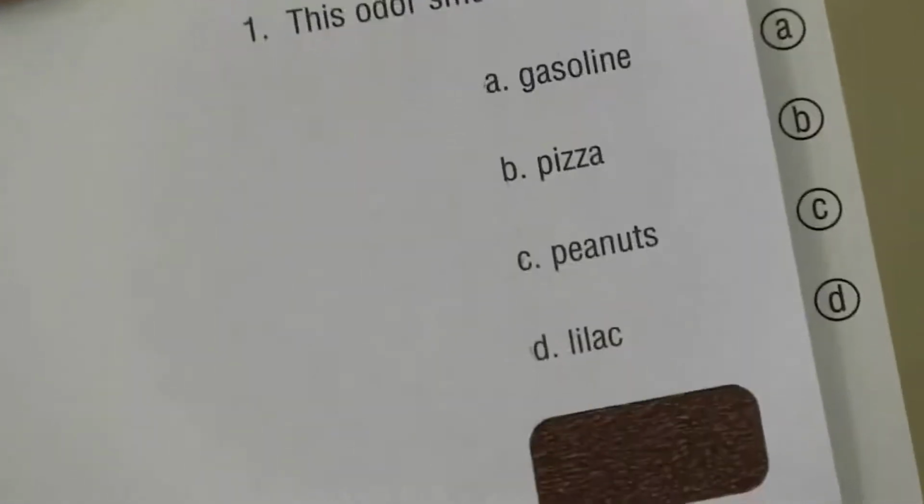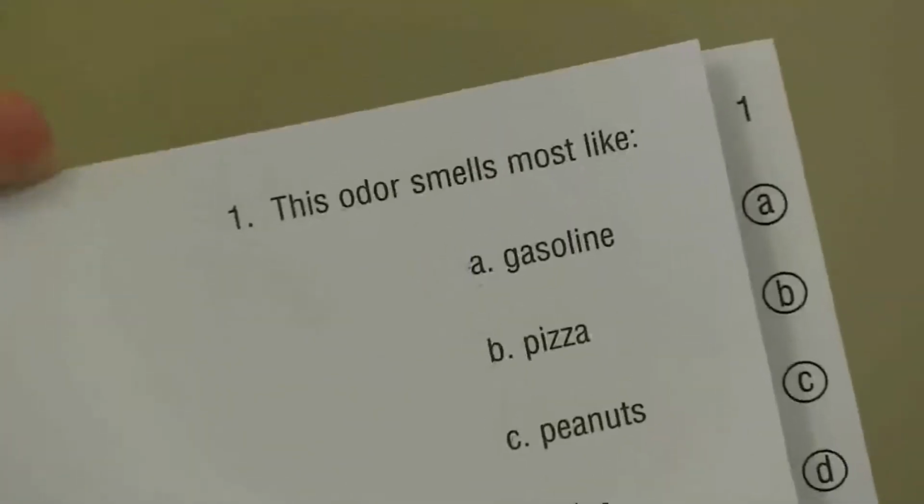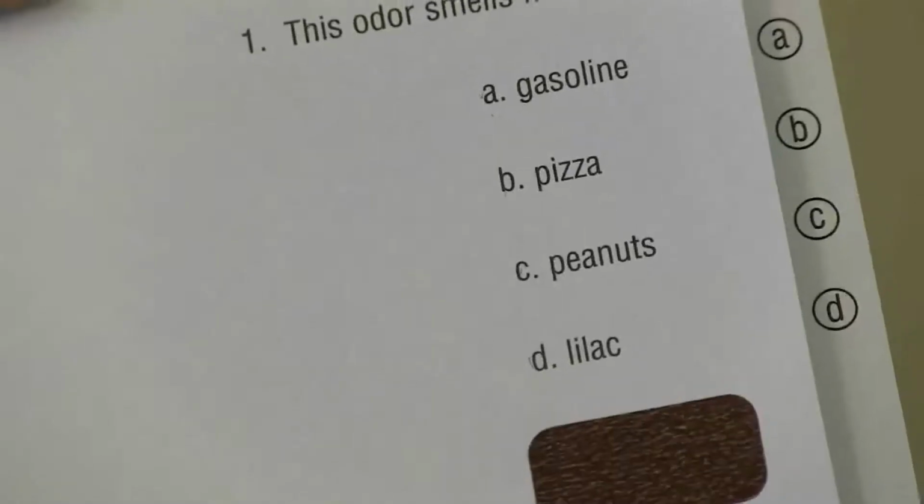Patients can self-administer this test, or it can be administered by a test administrator, as we'll do today. Each of the 40 test items has a multiple choice question. The first one is, does this odor smell almost like gasoline, pizza, peanuts, or lilac? We scrape open the odor and then have the patient smell it. When they give a response, we fill it in in the column to the right of the descriptions.